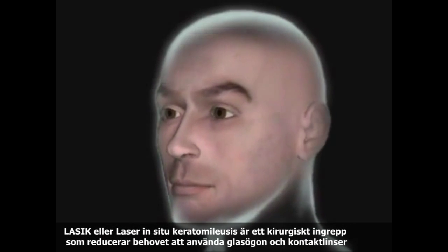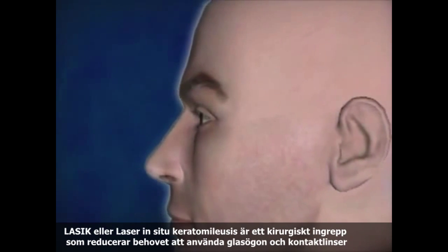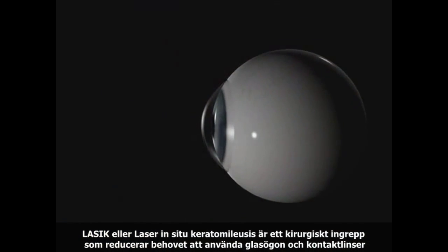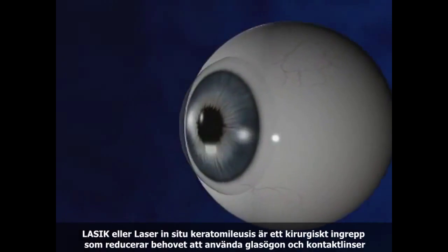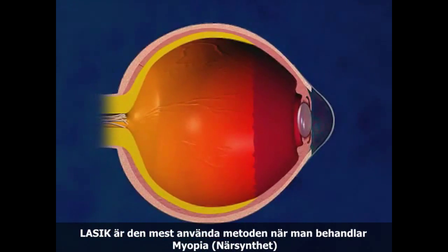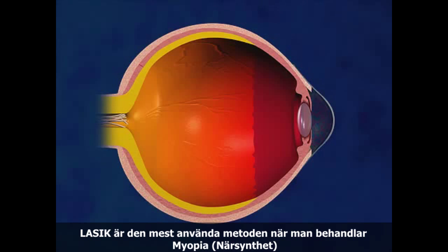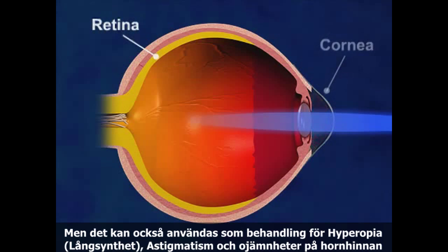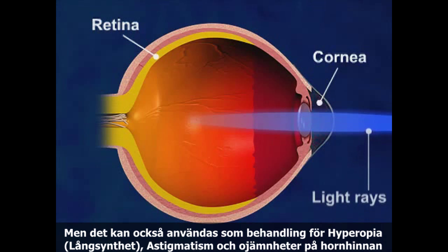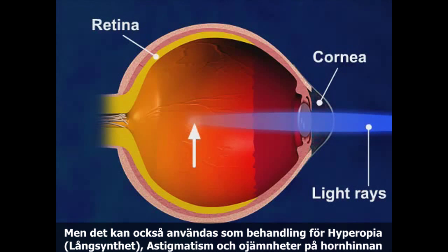LASIK, or laser assisted in situ keratomileusis, is a surgical procedure intended to reduce a person's dependency on glasses or contact lenses. LASIK surgery is most commonly performed as a cure for myopia, or nearsightedness, but can also be used to cure hyperopia, farsightedness, or astigmatism, corneal irregularities.